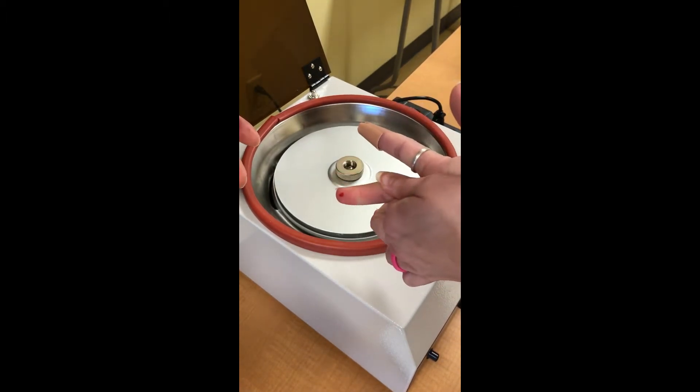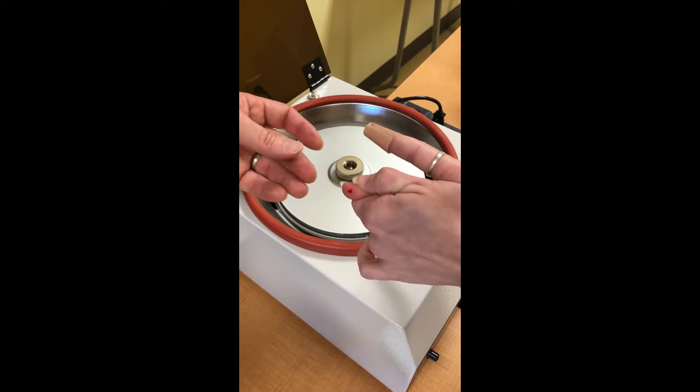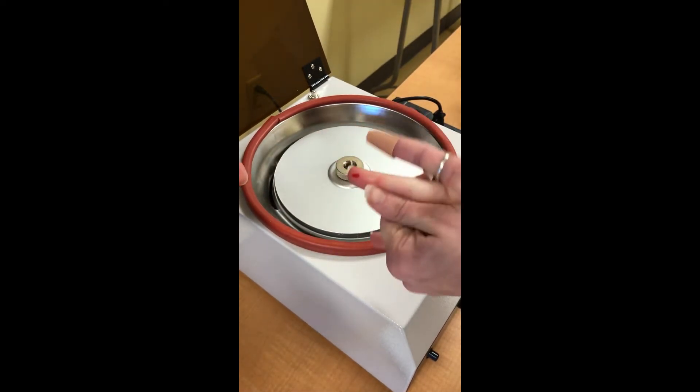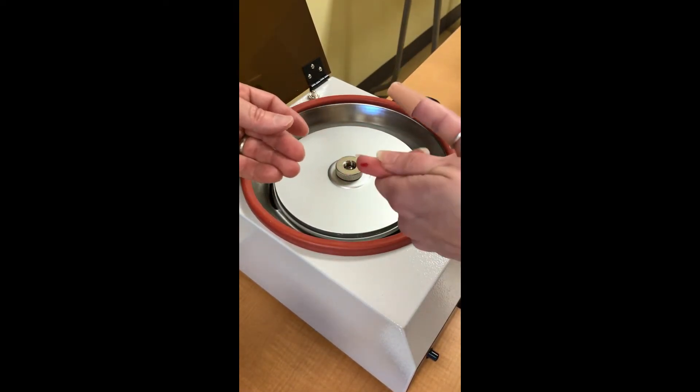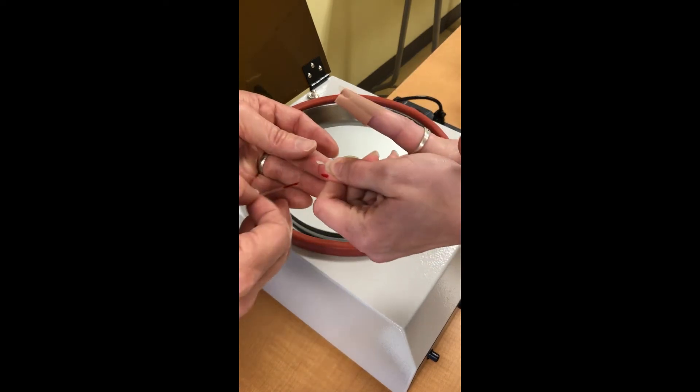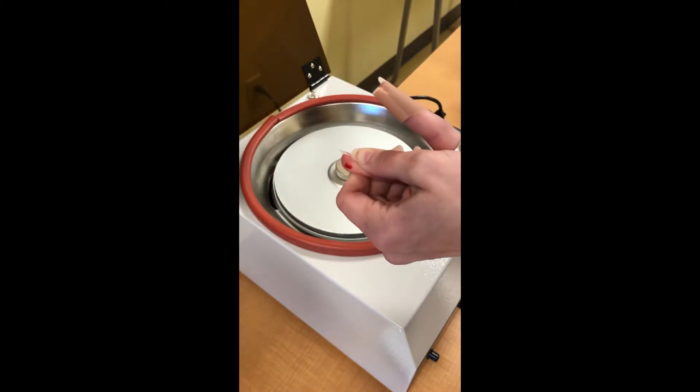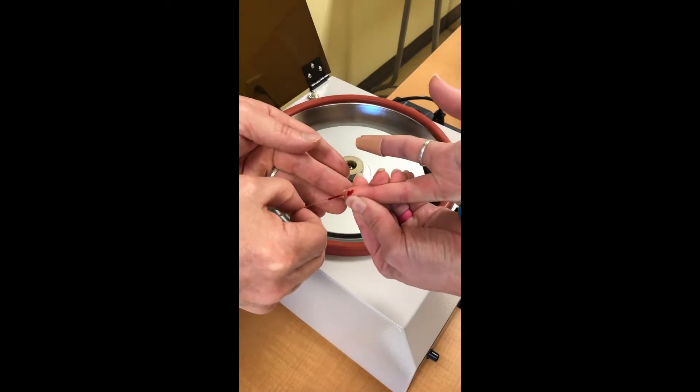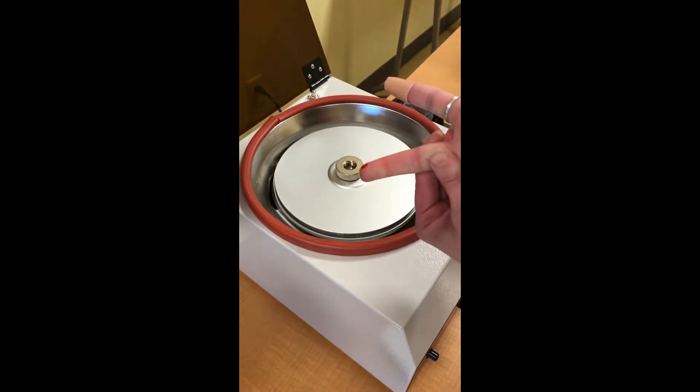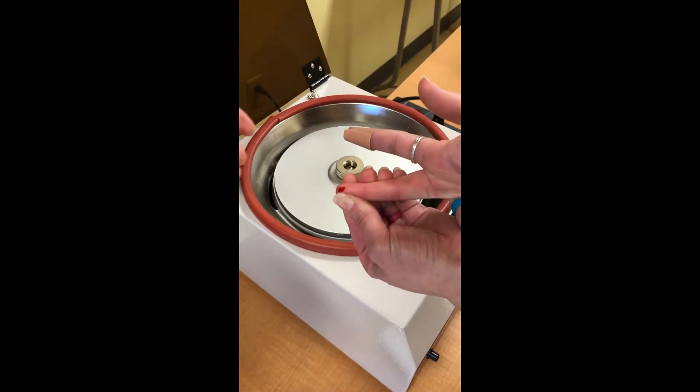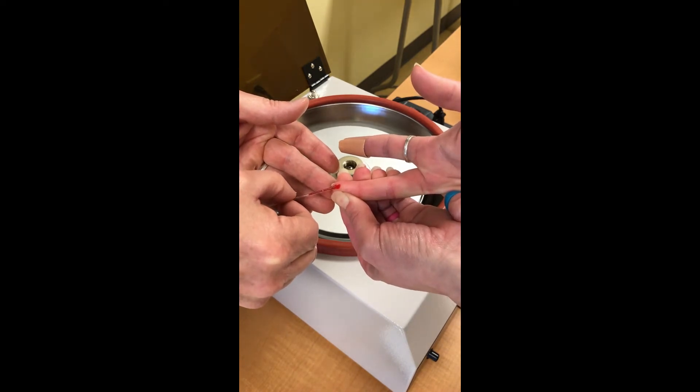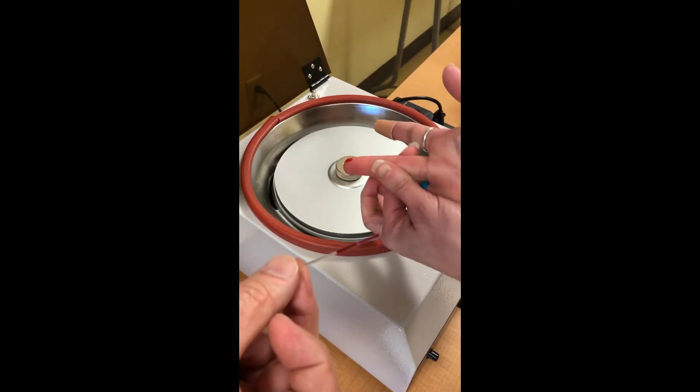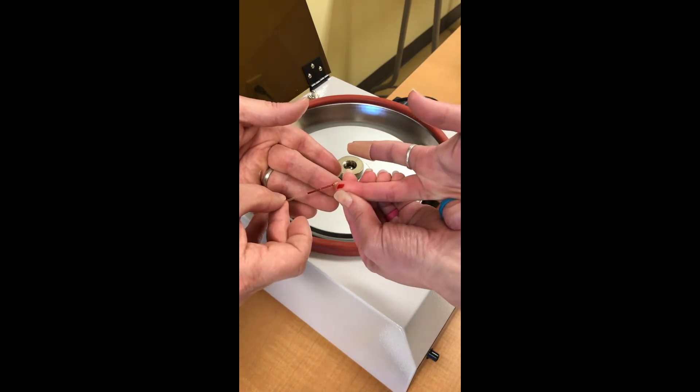Going to need quite a bit more with a cold finger. Blood vessels tend to constrict and it makes it just a little bit harder, and it is cool today. We need some big drops right there. Little tiny cold fingers take a little bit longer to get the blood out. Now we start to get a little bit. You can tell when it jumps into that tube - you can see it jump real quick. And I've noticed if you roll the tube, it tends to draw it right off the surface of the finger. So we've gotten some blood, maybe a third or so full at that point.